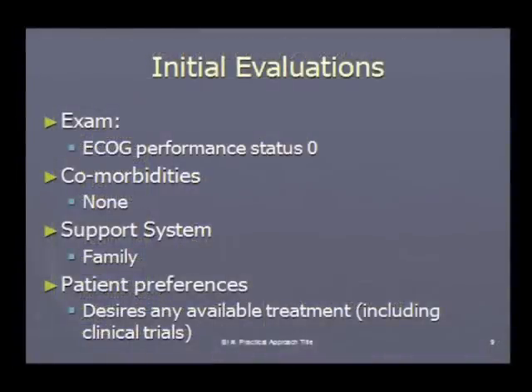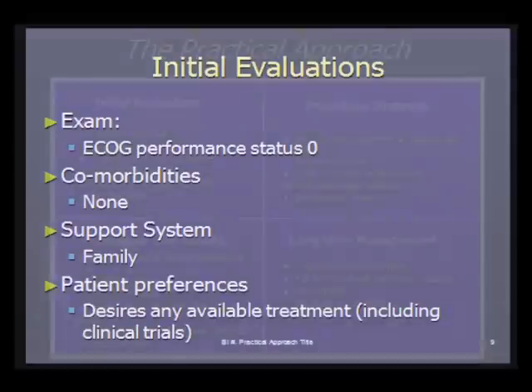For example, the current patient has no major comorbidities, but in a patient with underlying cardiac disease, considerations regarding anesthetic agents and need to hold antiplatelet medications would become much more relevant.